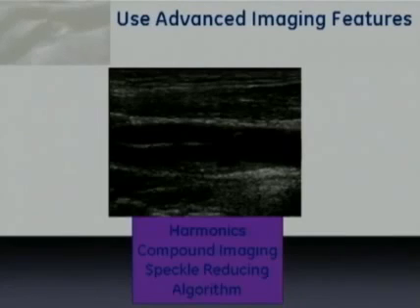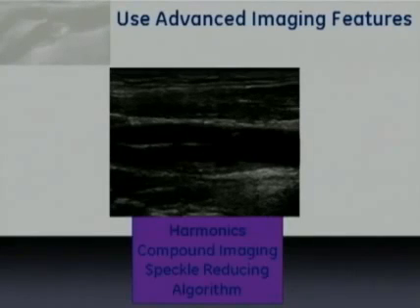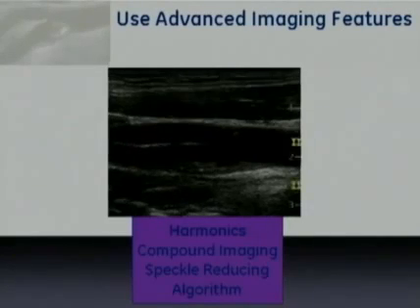And you can see that by layering these advanced imaging features, we steadily improve the quality of the ultrasound images. So for example, this is a pretty decent baseline image, but I think everyone would agree that it's a little bit better now, and now it's a little bit better, and then the final image is even the best.